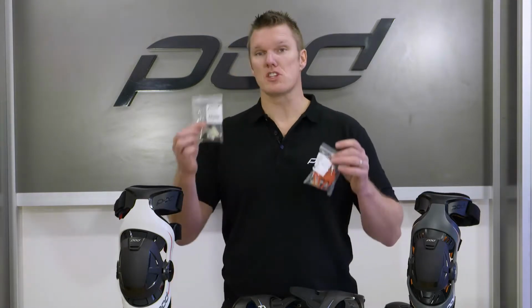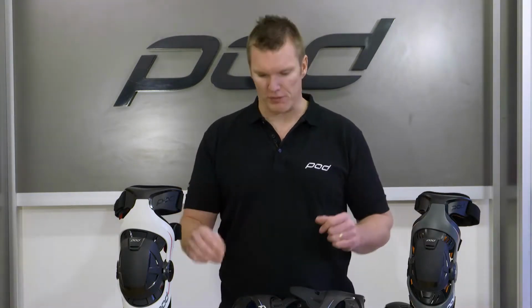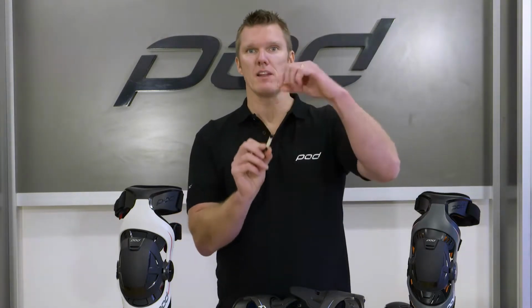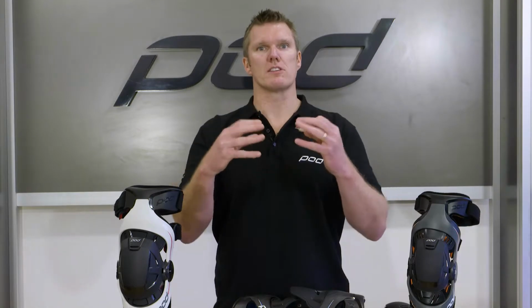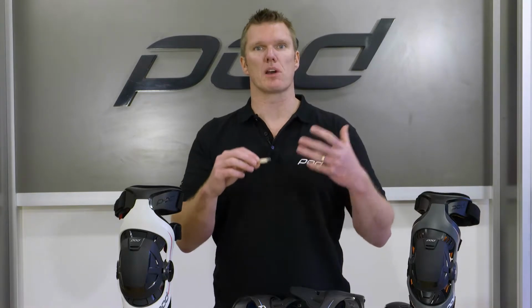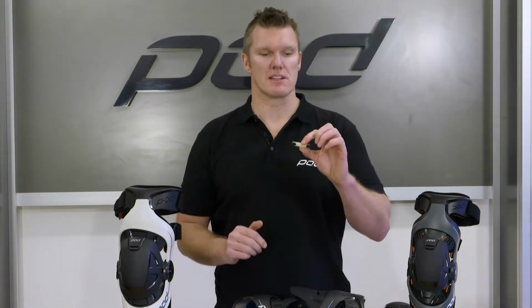You can simply though just buy the ligaments if you've broken them, if they've stretched or if they're damaged. We do encourage you, probably within a year, depending on the frequency that you ride, to replace the ligaments. They actually can hold 340 kilos, so in excess of 700 pounds of tensile strength. However, after thousands of bends, again, because they're emulating the human motion, they will start to stretch and they will slowly break down. So like the tires on the bike, like the chains, sprockets, a lot of consumables, the ligaments is probably the cheapest part of the brace and a piece that is designed to be replaced easily by you at home.